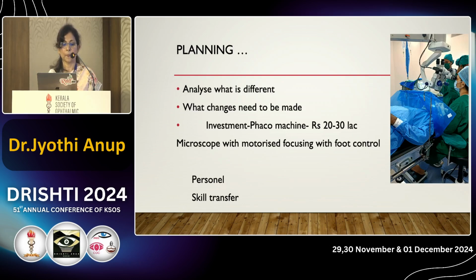And before starting phaco in your clinic, you have to make some plans and changes. The most important plan is to invest in a phaco machine and a microscope with XY coupling and motorized foot pedal. And besides your own training, you need to train your OT staff also to handle the machine.